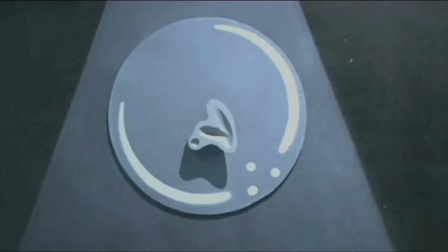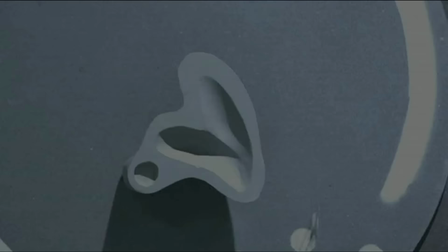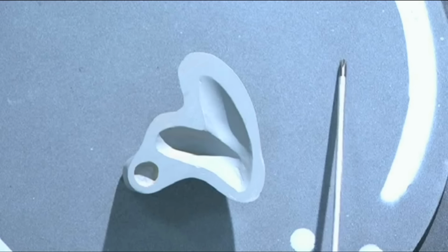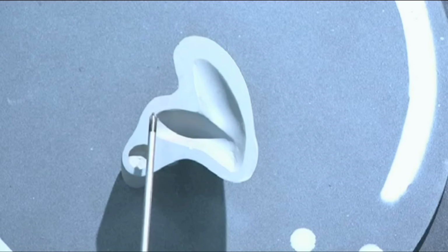Coming on to the last slice of the model, it again shows the arches in their relationship to the superior vena cava. In the illustration shown, the spine is on the bottom right of the screen, but in this situation, the left side of the baby is slightly towards the probe, so the head of the baby is into the screen with the feet out towards us. This means that the ductal arch, which you can see here, is on the left side of the baby, the aortic arch here, and the superior vena cava here.